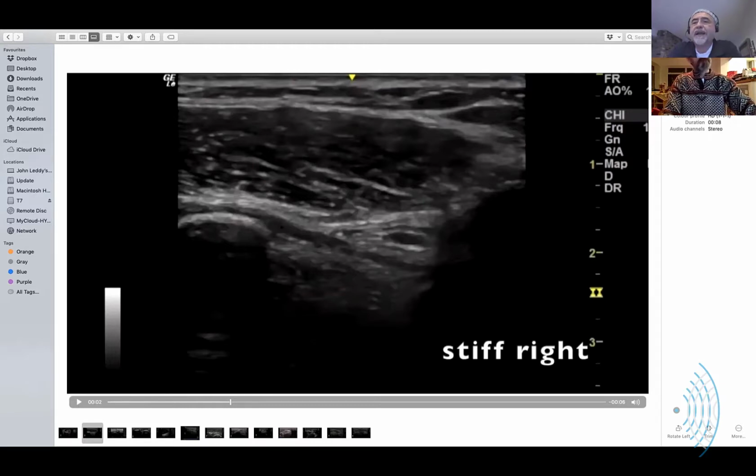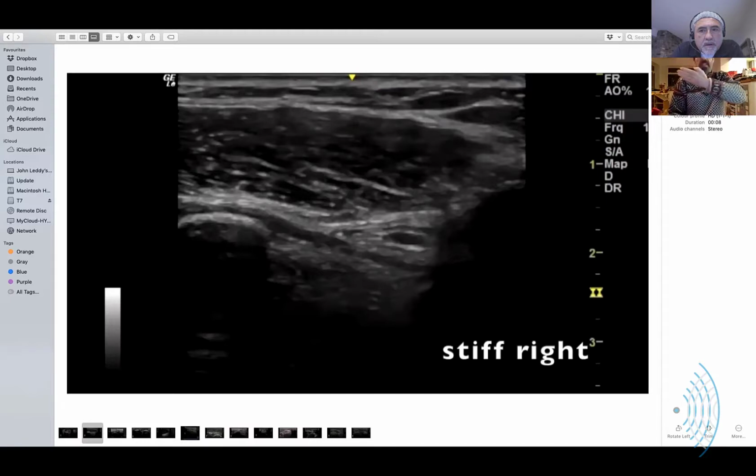But that's what I need to have, somebody videoing you do that. I think the trick is just to scan the coracoid. So tell me again, you're simply going short axis on the coracoid, looking for this hat, and you scan along it like this.